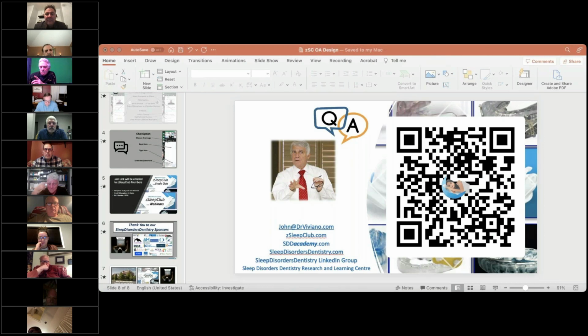When you're going to add more thermoplastic material, or Thermaline, are you using an adhesive? No. Never use an adhesive. That's in the instructions. The key to adding Therm is this: first of all, Thermocryl will adapt to Thermocryl, and Thermaline will adapt to Thermaline.